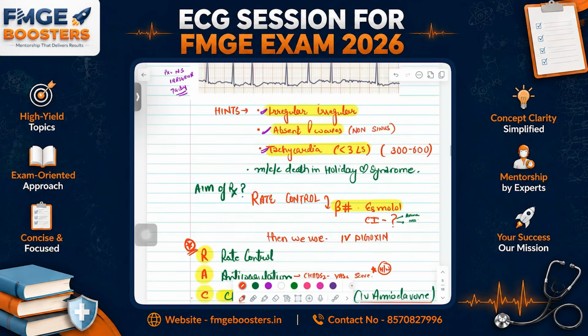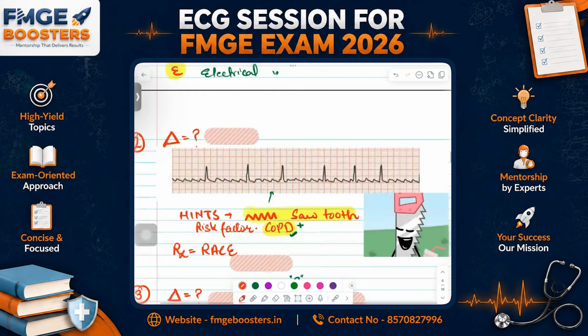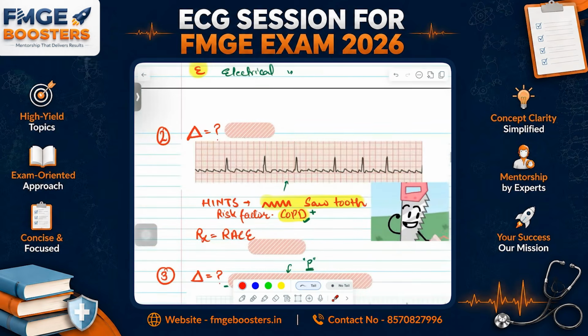Okay, no one will have any difficulty in this because it is an easy one. Now moving on to the next ECG, just look at this GIF and then look at this one. It is a PYQ. Okay, guys, the next important ECG is that sawtooth pattern, which everyone must know. It is a sawtooth pattern. What is the diagnosis here? If you see a sawtooth pattern and the risk factor is COPD, then the diagnosis will be atrial flutter.